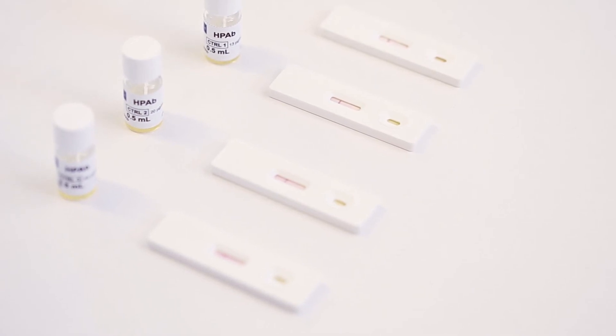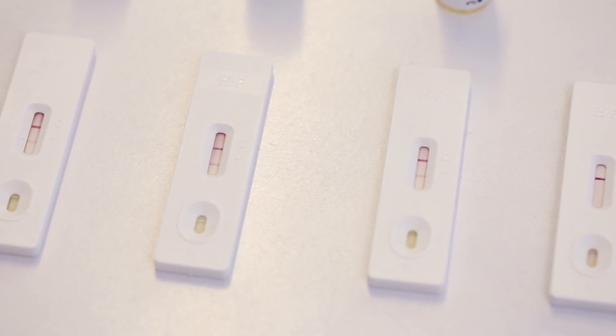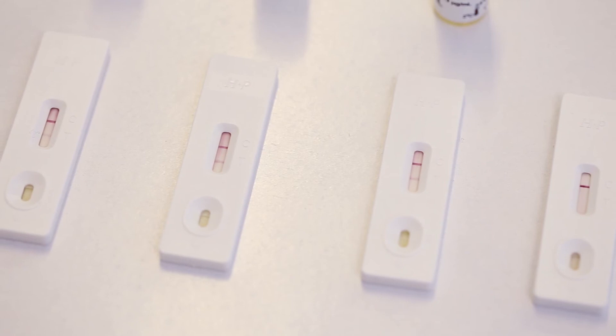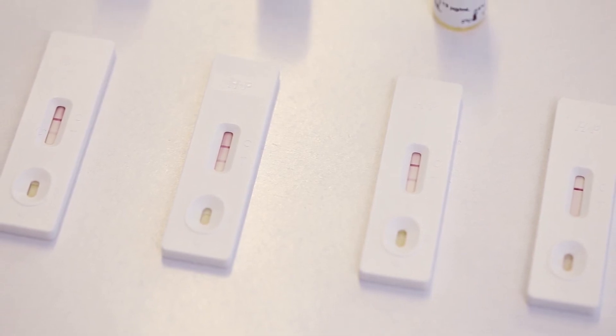A test is negative if only the control line is visible. A test is positive if both the control line and the test line are observed.